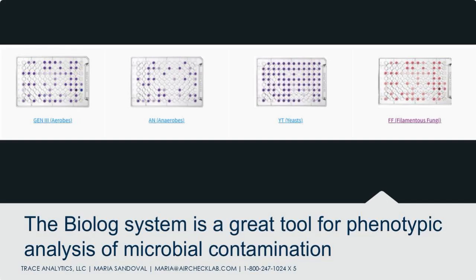So if you don't know, aerobes are organisms that grow in the presence of oxygen. Anaerobes are organisms that grow in the absence of oxygen. So if you guys are testing nitrogen gas and you're worried about organisms growing in your nitrogen gas, then you're not going to choose to incubate your plates in an aerobic environment. You're going to choose to incubate your plates in an anaerobic environment.